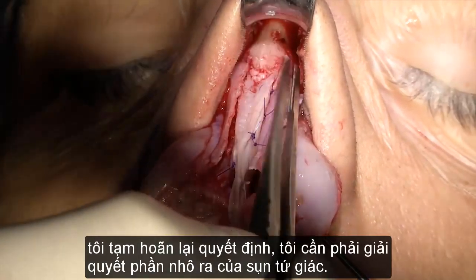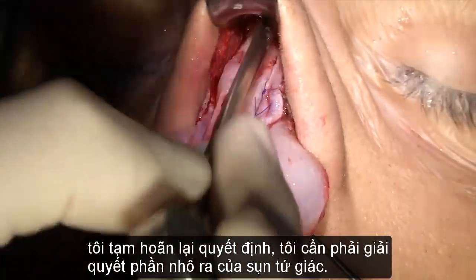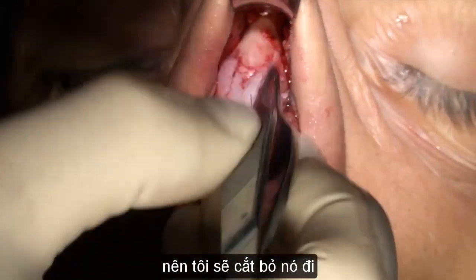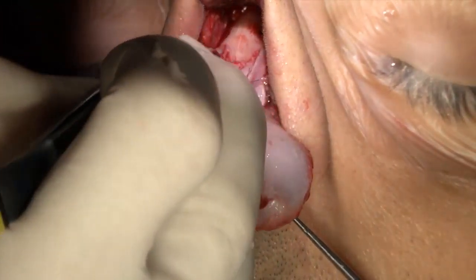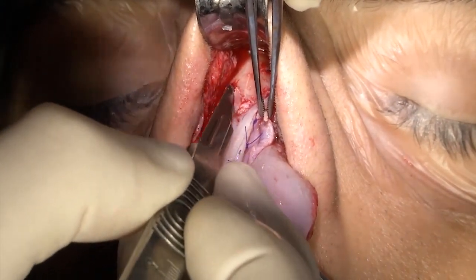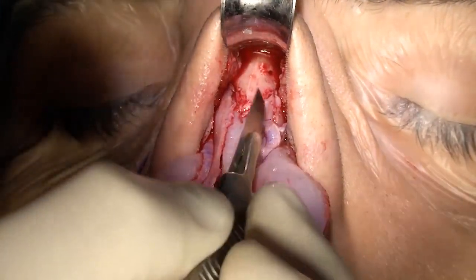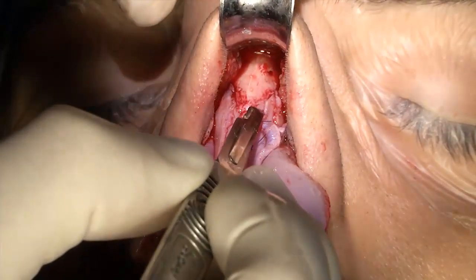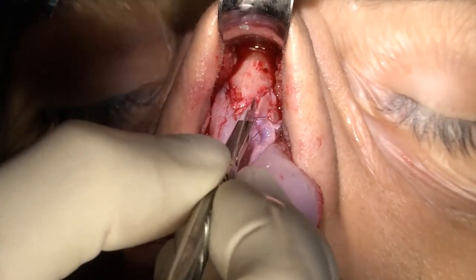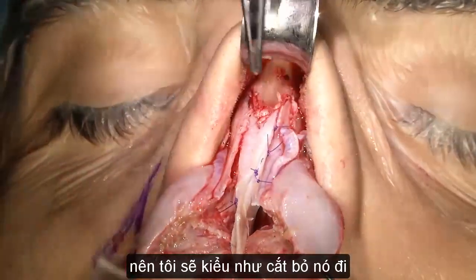So I am postponing this decision, but I have to do something with those protruding edges of the upper lats. So I will just disinsert them, I think. So I kind of straighten them somehow. All right. So I just kind of cut it off.